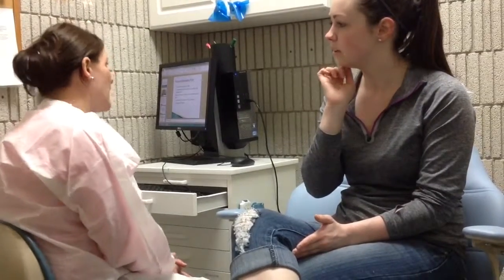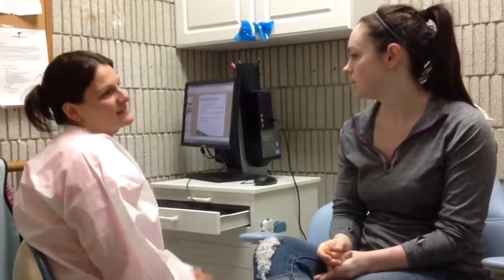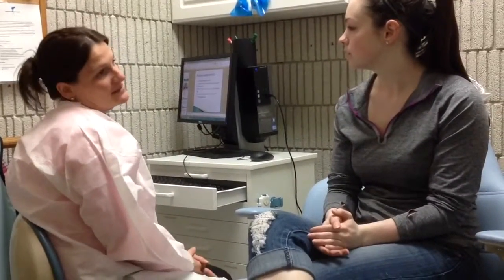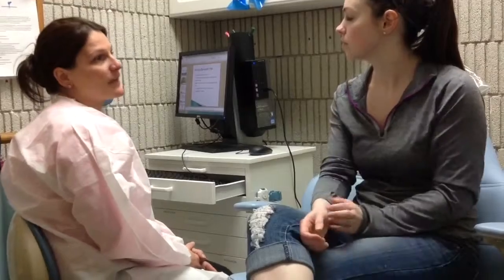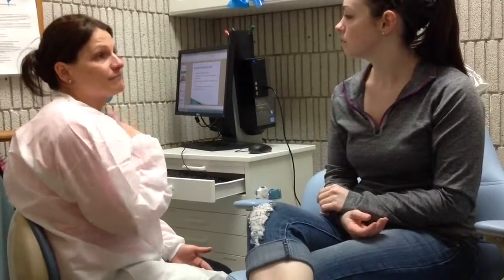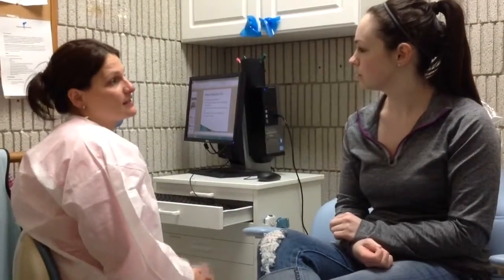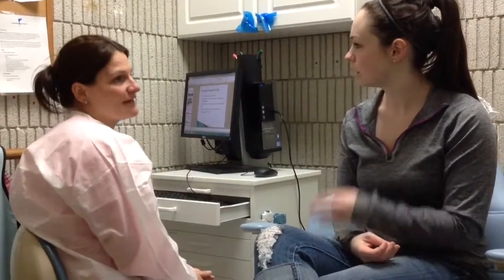Okay, what you're talking about is commonly known as a wisdom tooth. Have you heard of that? Yeah. Really the technical name is a third molar. Some people have all four of them erupt, because you do have four of them in your mouth. In most cases, but sometimes you don't, and the best way to see if you have them, if they're going to come in, if there's space for them, because sometimes there's not space, is to take a panoramic x-ray.